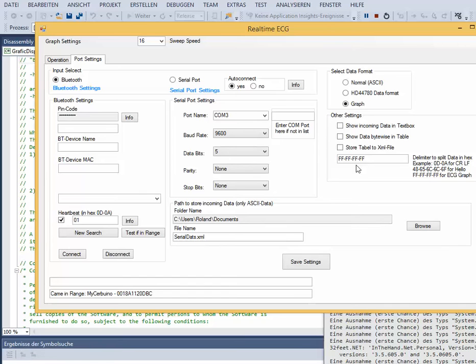The delimiter means the sync bytes between the data packages. It must be 4 times hex FF for this application.